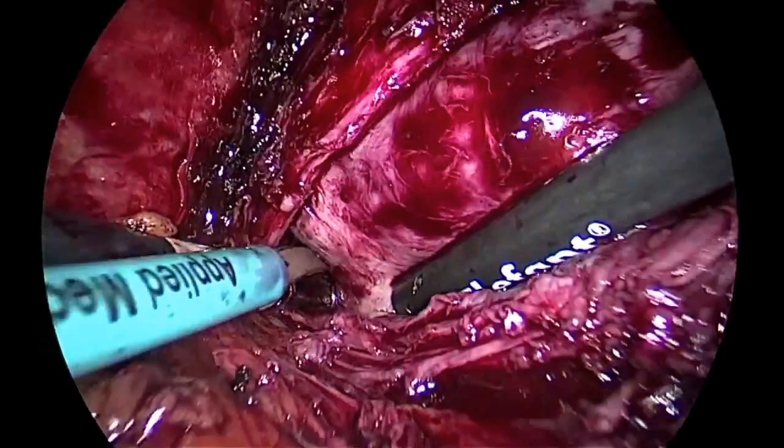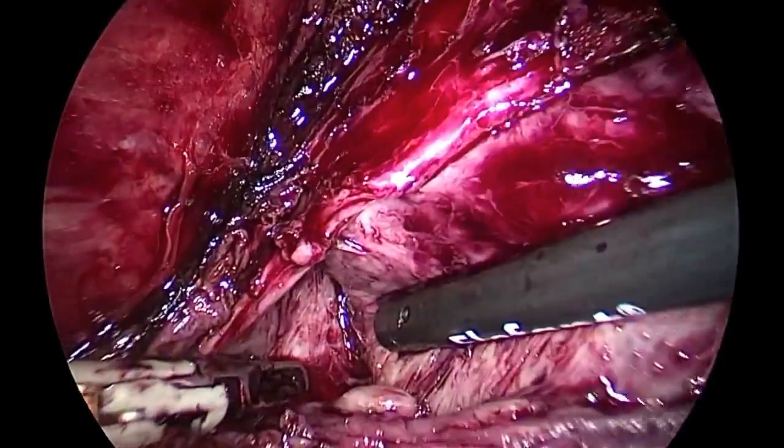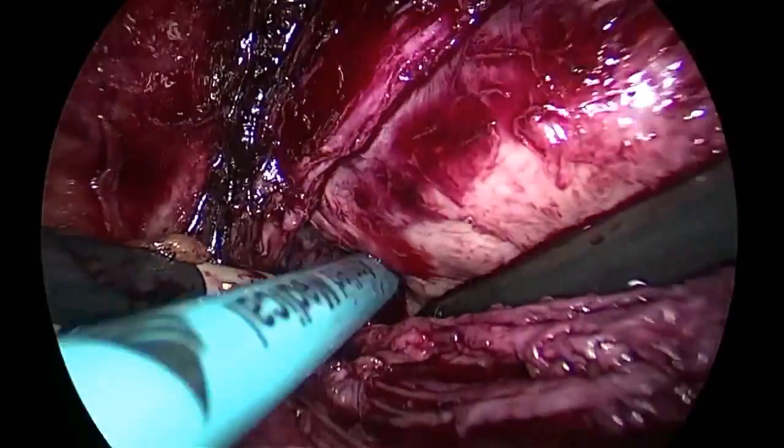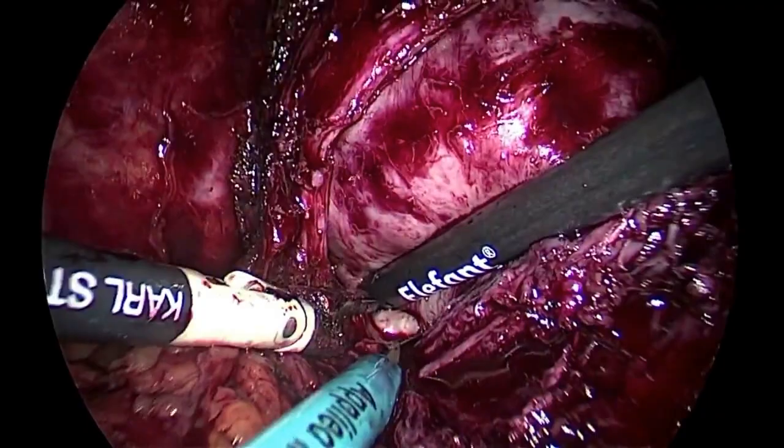The dissection begins laterally, in this way. Can you look at better? It's a perfect enucleation, step by step. And so it's very important to perform an enucleation. Perhaps during the dissection phase, some bleeding can be visualized, and so it's important to electrocoagulate like this.